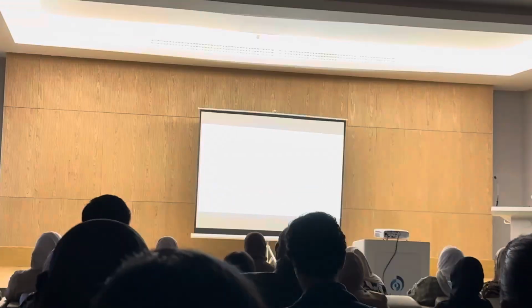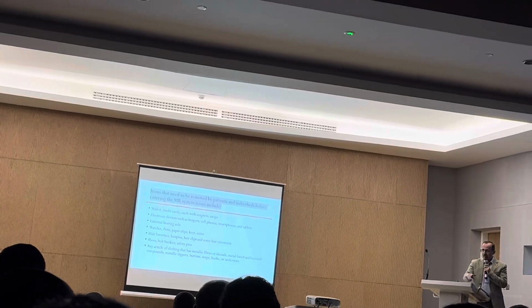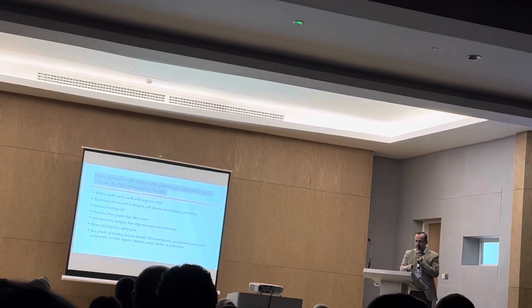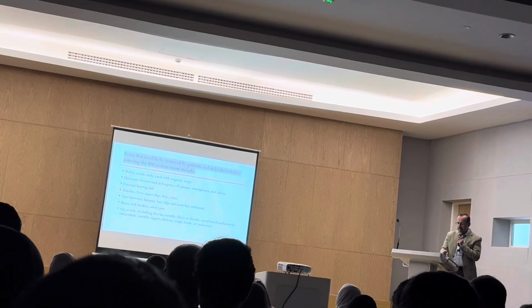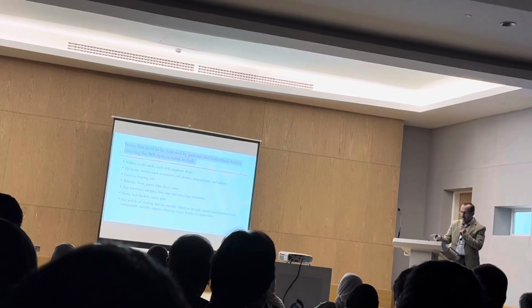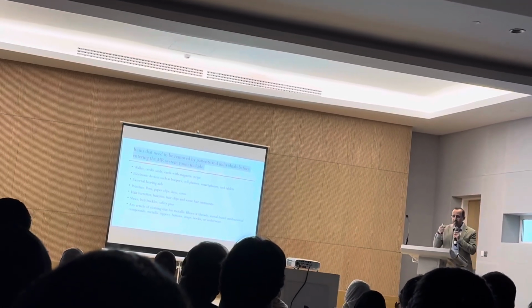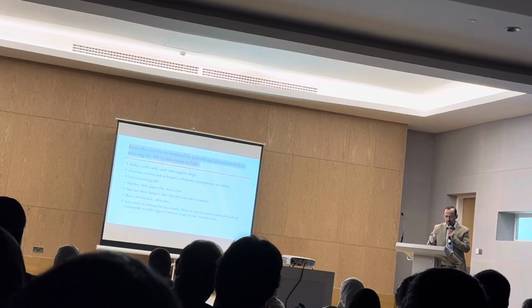Some other contraindications are wallets, credit cards, and magnetic strips. The prohibition is because they will become dysfunctional. They will not work after leaving the MRI room. Also external hearing aids, devices such as beepers, phones, watches, pens, and coins. For women, makeup will heat in the magnetic field and should be removed.